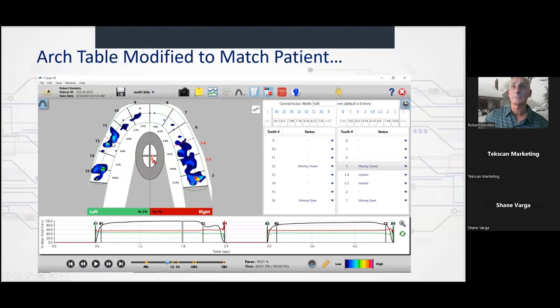This is essential because let's say I want to treat this contact on 13 central fossa. It's not 13 central fossa if I don't take out the right teeth and space the arch correctly. So this arch is spaced correctly. And again, labeling your implants is the only way to activate an implant warning. So this is the icon to make adjustments within a recording, the tooth arch.